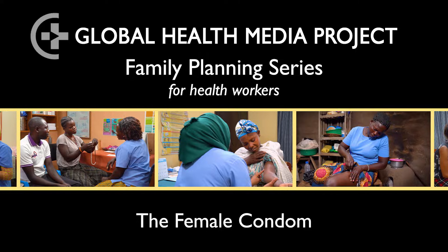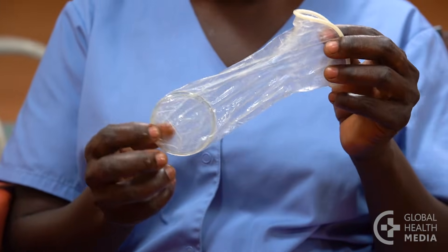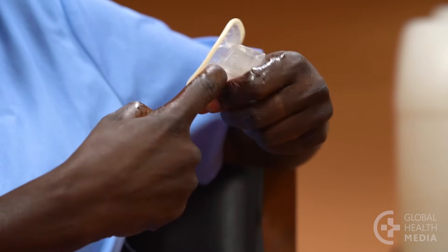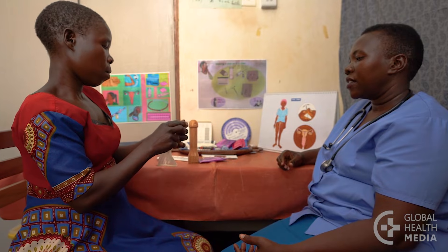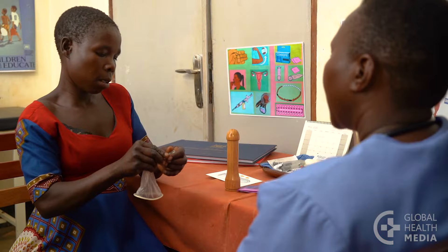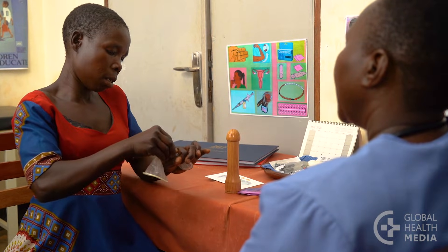A female condom is a thin, lubricated pouch a woman puts up inside her vagina before sex. It can prevent pregnancy and protect her from sexually transmitted diseases, including HIV and HPV, which causes cervical cancer. This video will describe the female condom and show how to use one.